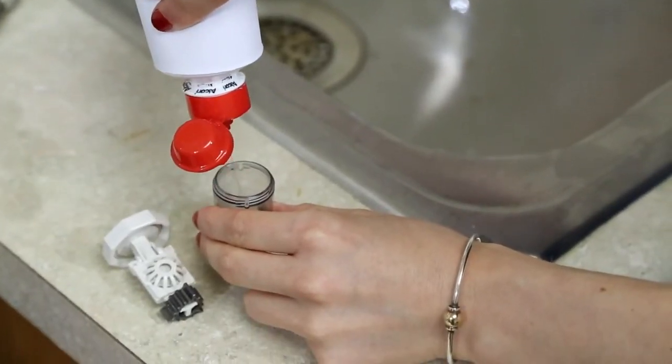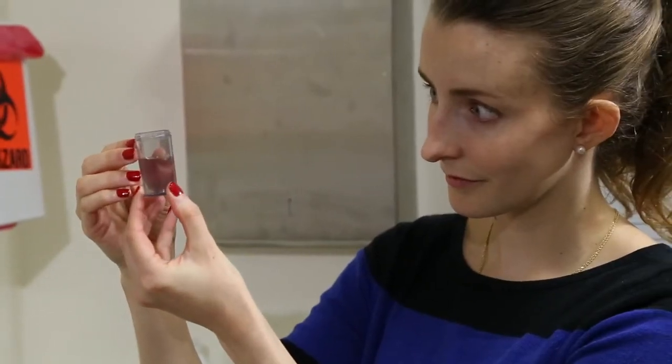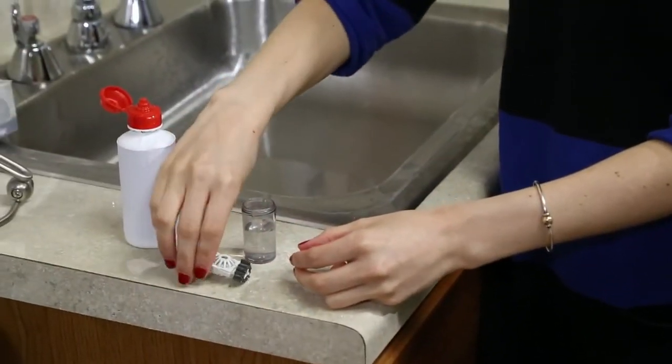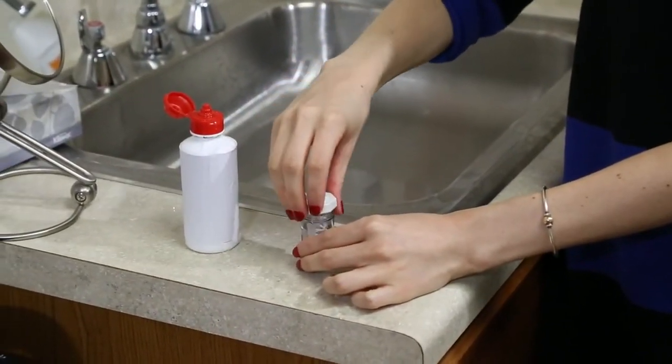Once the lens is removed from the eye, it is important to make sure that you clean it before placing it back in the case.